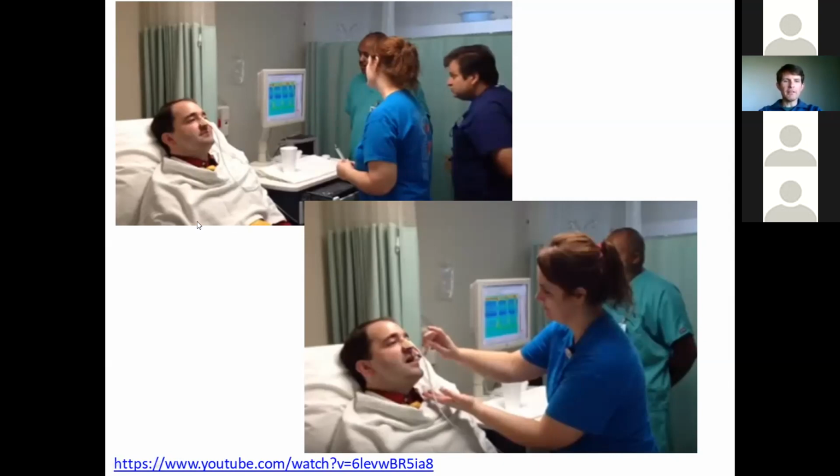The patient is seated here. They're in a sort of semi-recumbent position. You can see the catheter has already been placed. And then the core portion of these studies is acquired when the patient performs a liquid swallow with a saline solution. So it's 5 milliliters of a saline solution that the patient ingests. They're asked to hold it in their mouth temporarily and then perform the swallow. And then that information is acquired real time here on the software package. Once the study is complete, the technician in the lab then can make that available to whoever is actually going to interpret the study.